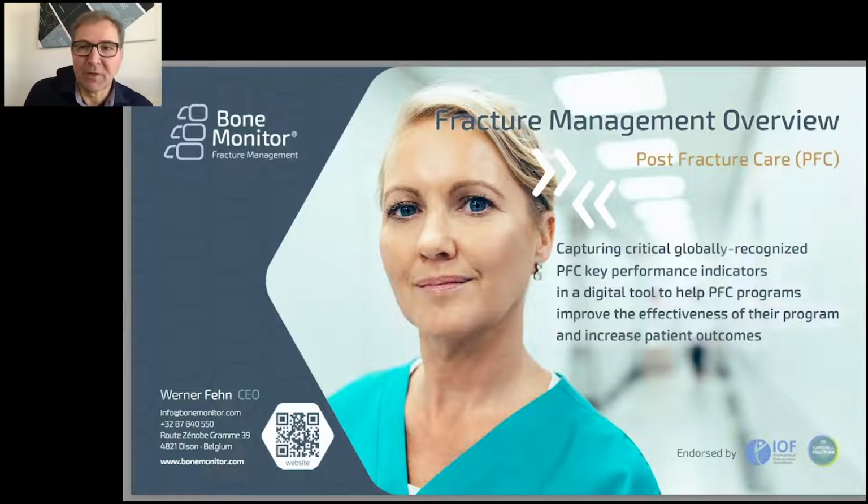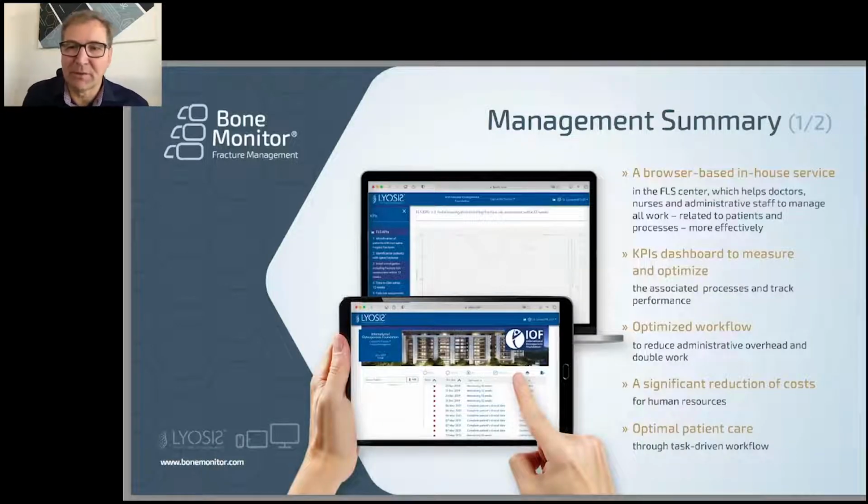Our fracture management software is capturing critical globally recognized PFC key performance indicators in a digital tool to help improve the effectiveness of your program and increase patient outcomes. At a glance, it's a browser-based in-house service. That means it is running on every device which holds a browser, because the software is installed in your IT infrastructure in your hospital, and that means all the patient data are kept in the hospital.